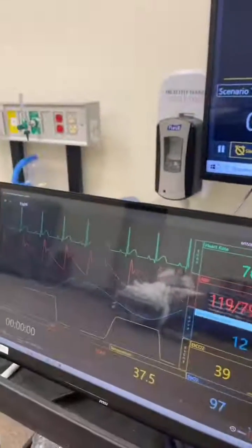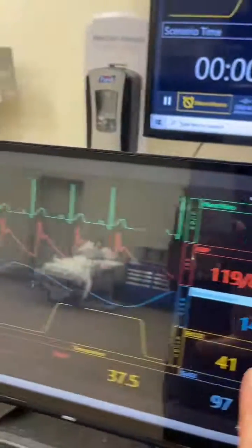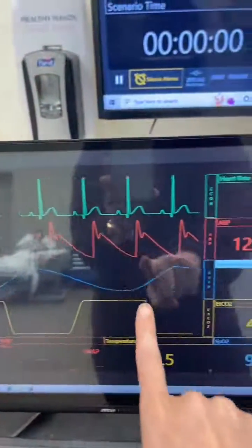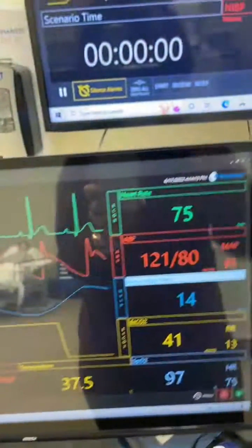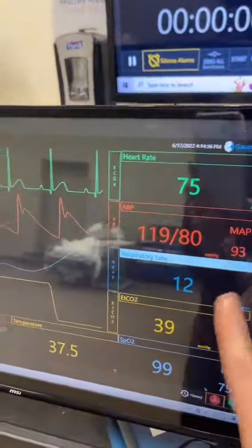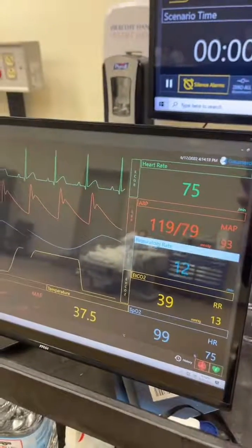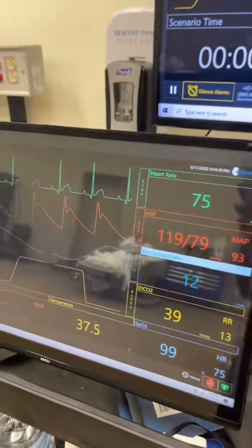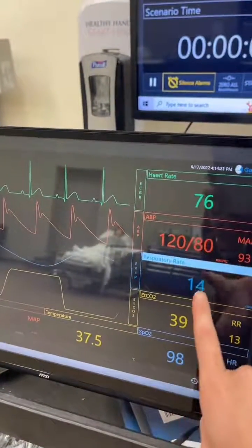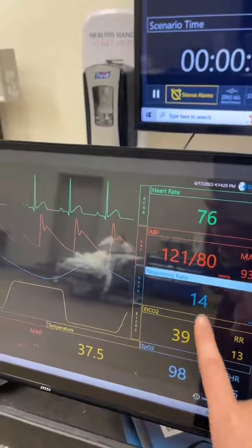Back to this — the 12 in blue is our respiratory rate. I kind of take this with a grain of salt; it's not always the most accurate. If you need a good respiratory rate, I highly recommend just taking it yourself, because a lot of things can make this inaccurate.